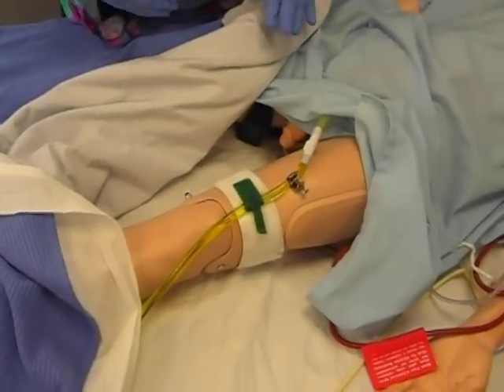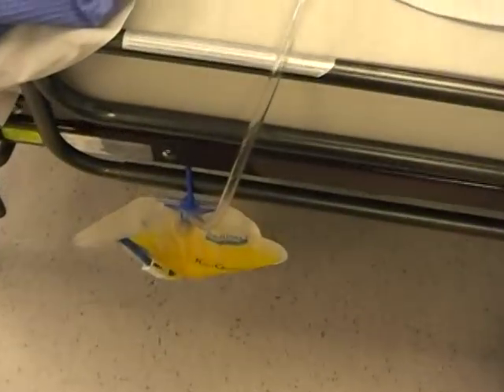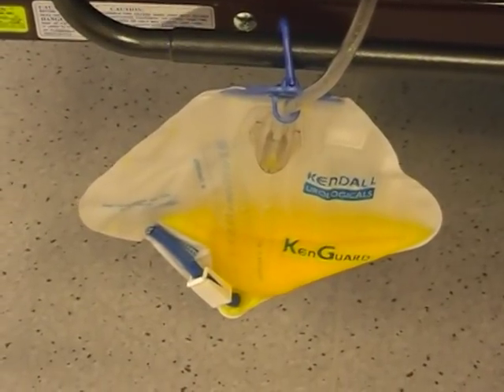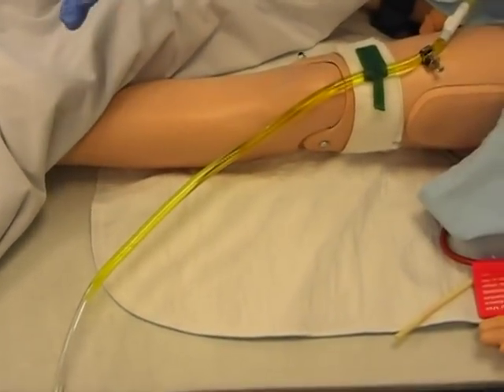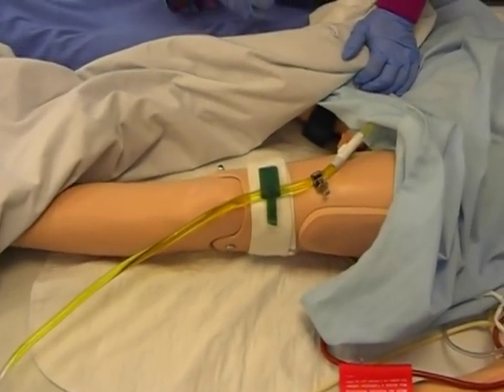Now in order to obtain a sterile specimen, we're actually not going to use the urine that's in the bag, because even though it's a closed system, we don't know how long it's been sitting there. As urine sits there, it grows germs, microbes. So we don't want to use that urine. We want to use the urine that's closest to the body — the fresher stuff that's come out of the body.